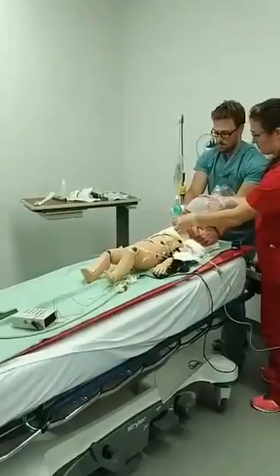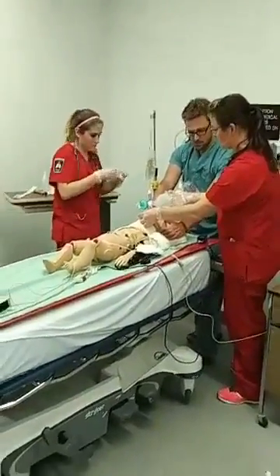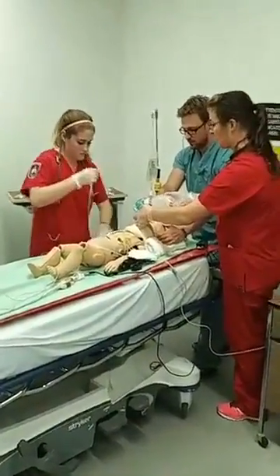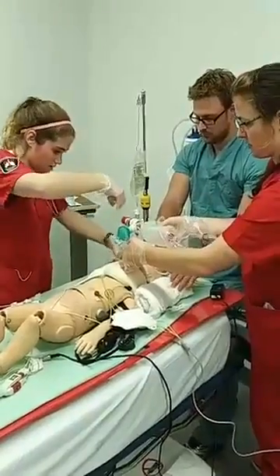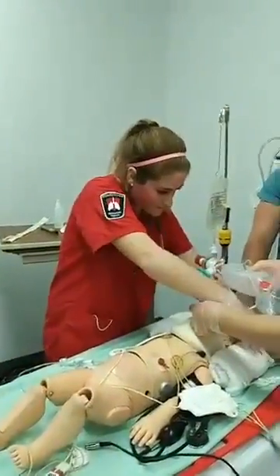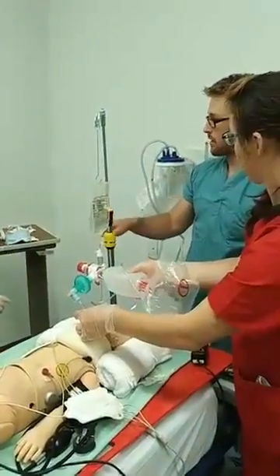Dr. Waters, we have a patient down here in trauma 2, the 4-year-old boy who was in an MVC in his car seat. Make sure that tube's good and secure on that side. Okay, we probably have a bleeding happening. We're probably hemorrhaging. So I think we need to go to the OR stat. Okay. We need to pack up and transport out. So what do we need to do a good transport out? How about you get ready for transport?